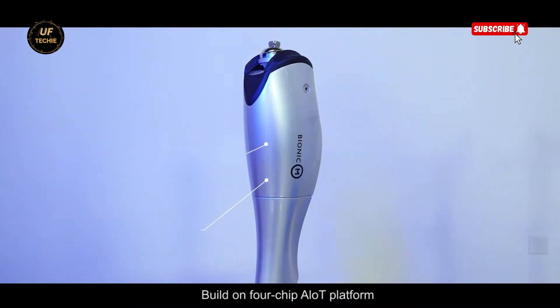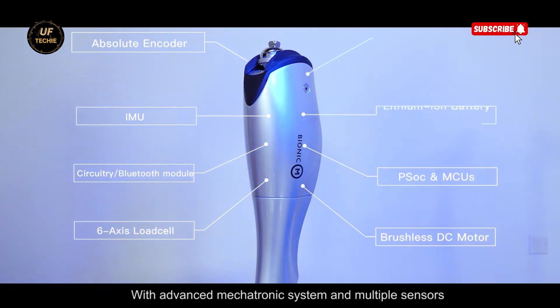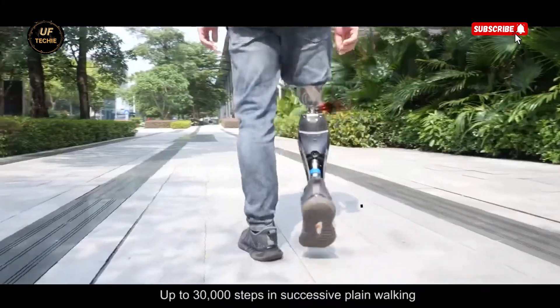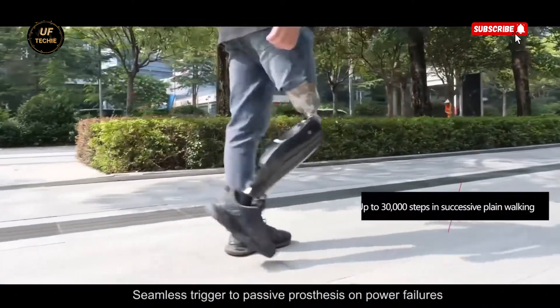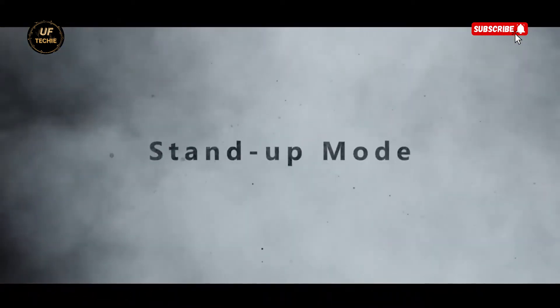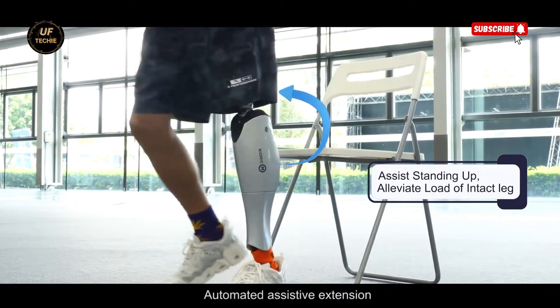It fuses cutting-edge bionic technology with the intelligence of humanoid robotics to create a safe, stable, and natural walking experience. Designed with a focus on real-world usability, it offers powered motion that mimics biological muscle movement, using what Bionic M calls a biomuscle-assistive system. This technology supports smoother and more stable mobility, allowing users to walk with confidence, whether they're indoors or out in the real world.